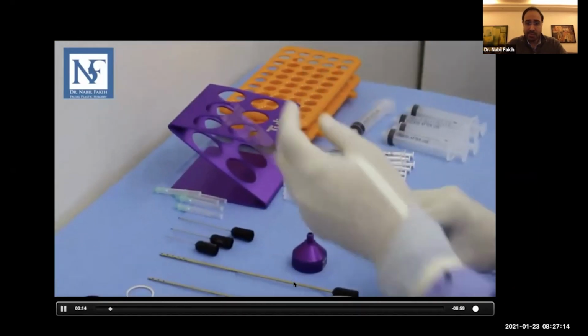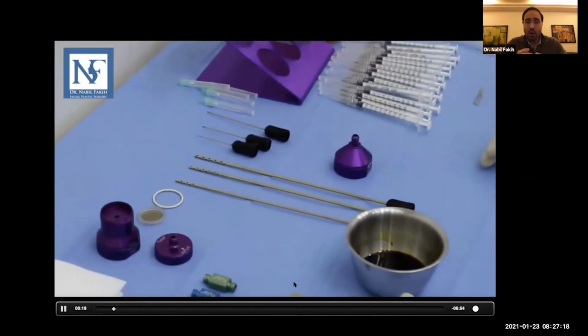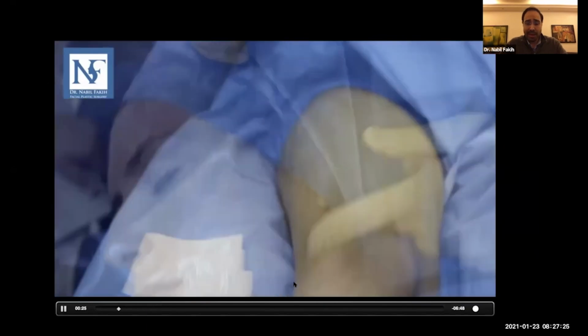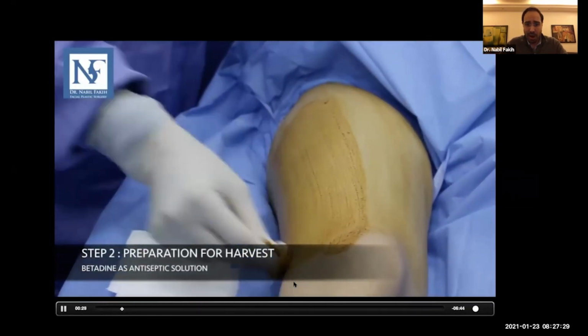It's from A to Z, everything step by step, how we do the procedure. But I will go quickly through it. It's a long video. I've just copied part of it. So we prepare the face, we put some lidocaine anesthesia, or you can do it with sedation. You find a place to harvest.